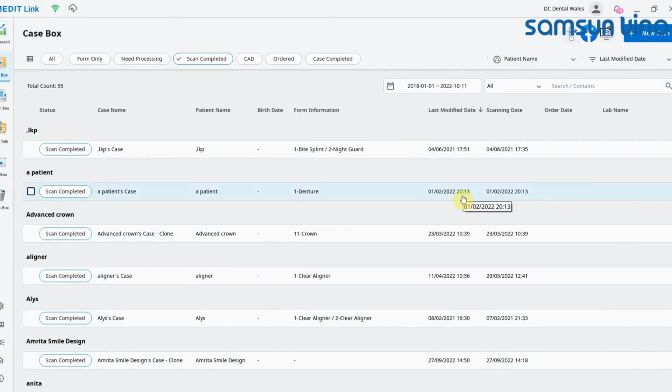The next problem is: I was shown how to partner with a lab when we first were installed. We've made some changes to the labs we use, and we want to partner with them again. How do we do it? Okay, so the easiest way to do this is to go down to the home icon from Medit Link, the My Account icon. And this will open up your cloud account. You'll see your case box.